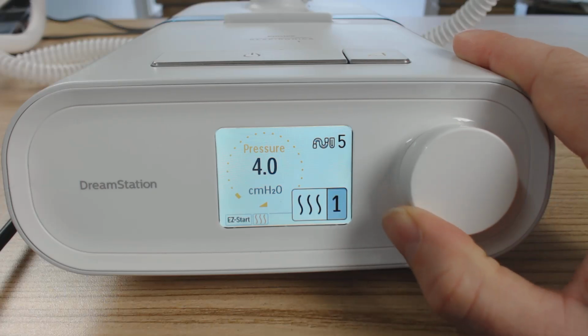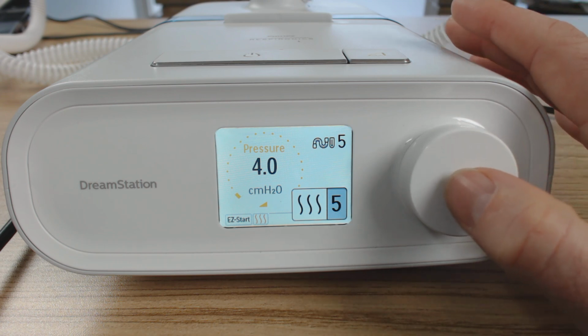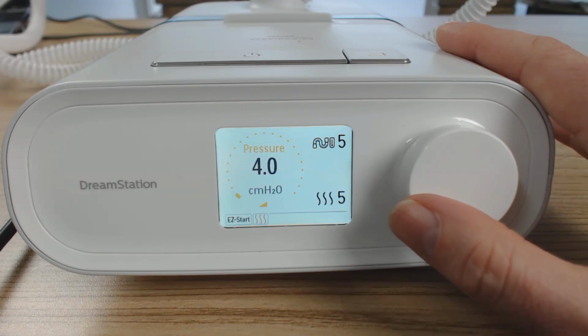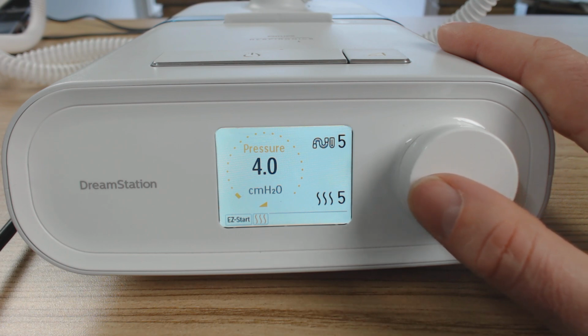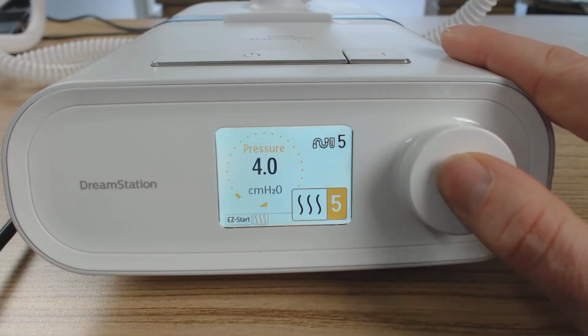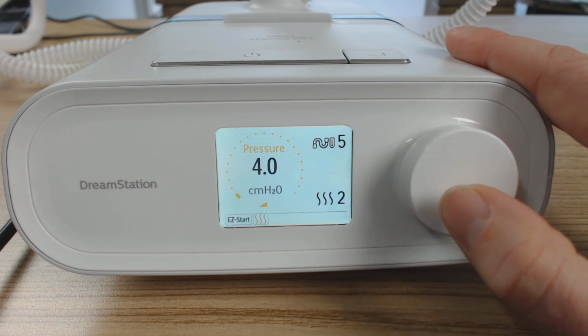So this is off, a little bit more moisture, a little bit more moisture, a little bit more moisture. So if we're dry in the throat or waking up a bit parched, we might need a bit more moisture. But also remember that if you're running a lot of humidification, so a lot of moisture, there's a chance you're going to get more rain out, so more condensation. So you might want to turn this down a little bit if you're getting a lot of condensation build up, all right? But just play around with those two things.